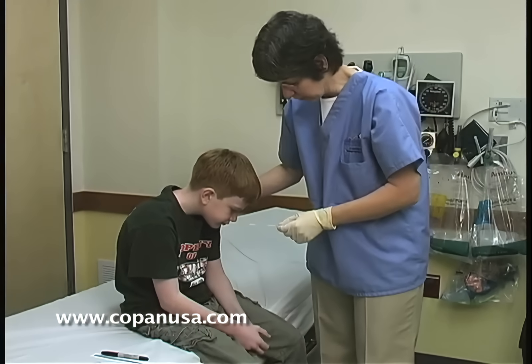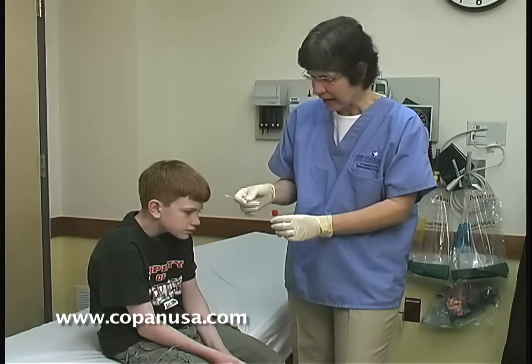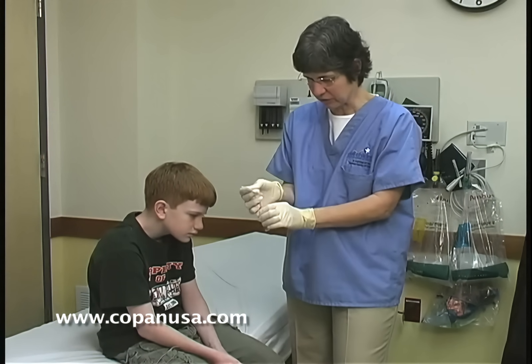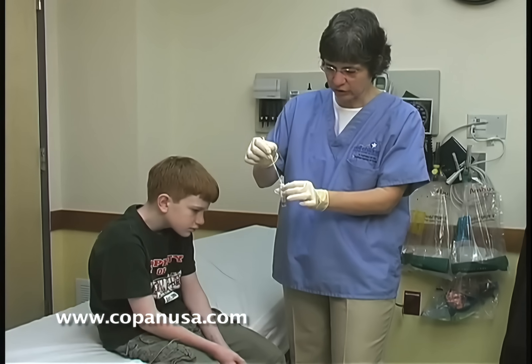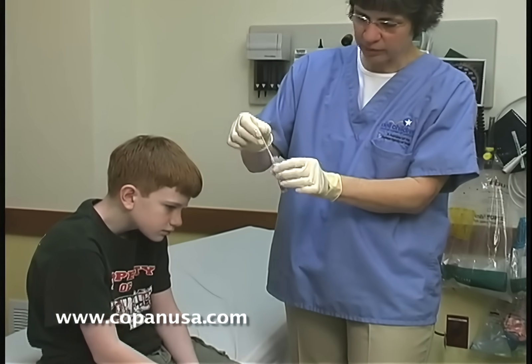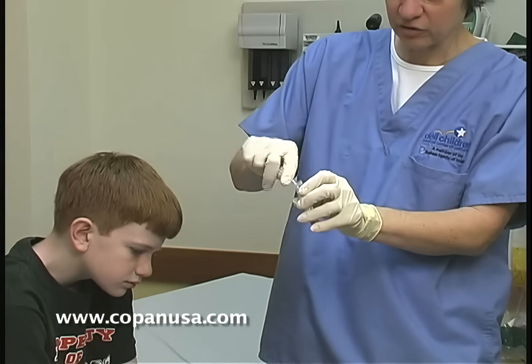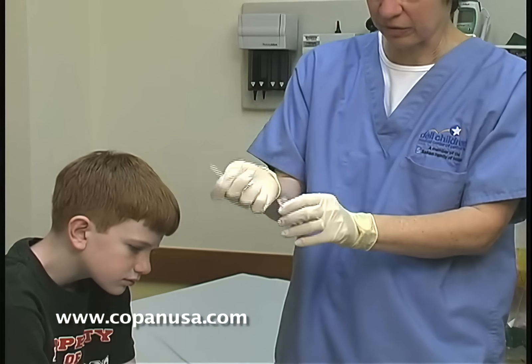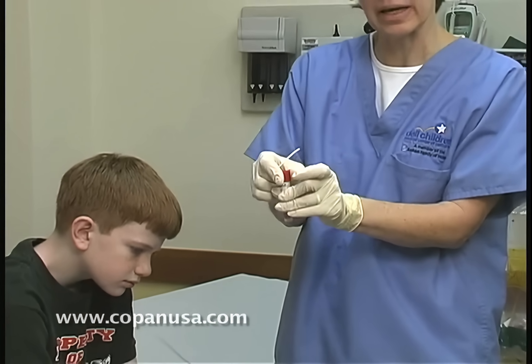I'm sorry you feel so poorly, Steven, but this will help us tell what's wrong with you. After you take this swab out, you can use it at the point of care or you can put it into a tube of universal transport media. Take it, mix it just a little bit — you can see this nice red line which is your break point. You put it in the tube and snap it right off, recap it, and it's ready to go off to the lab.